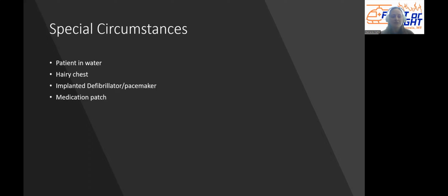and it'll look really obvious. Now, if they have that, you want to make sure your AED pads are at least 1 inch away from that pacemaker. So if it's on the upper right collarbone, it may be in your way. You can try to turn the pad on its side, move it down or to one side or the other just a little bit to get away from that pacemaker. But if you can't get at least 1 inch away, your other option is to apply the pads in what we call the anterior posterior placement. Remember, anterior is the front surface of the body, posterior is the back surface of the body. So AP placement would be you put one AED pad right in the center of the chest, basically right on the sternum, just right in the middle of the chest, and the other AED pad would go right in the middle of the back.